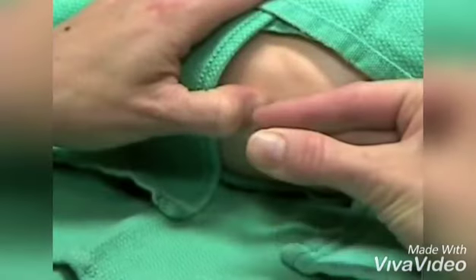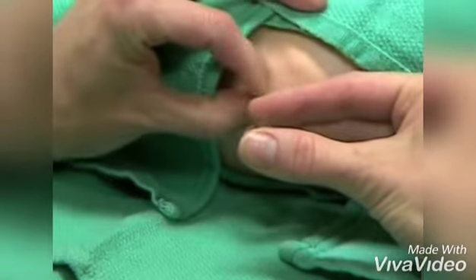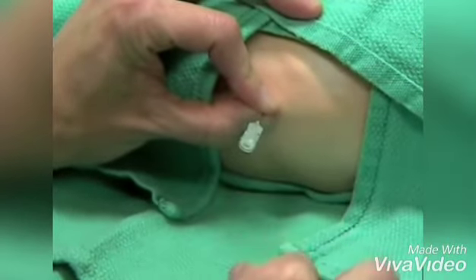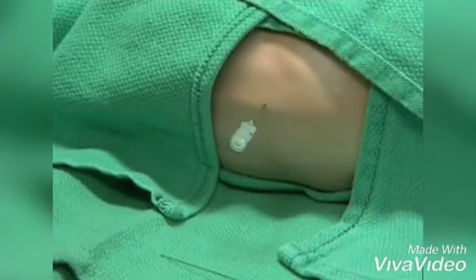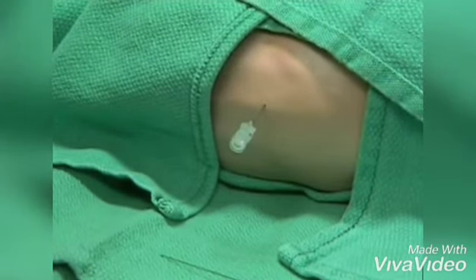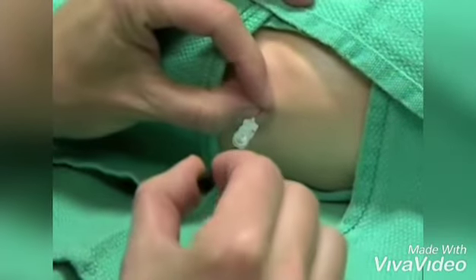As you move the needle in, you may or may not feel a change in resistance, often called a pop. If you're not sure if there has been a change in resistance, periodically take the stylet out and see if there is CSF flow. If you cannot get flow, put the stylet back in and go a bit further and check periodically.